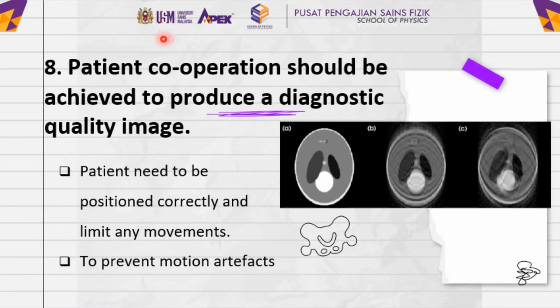Also, patient cooperation should be achieved to produce a diagnostic quality image. Patients need to be positioned correctly and limit any movement during the treatment. This is to prevent any motion artifact in the image that will be obtained from the treatment.